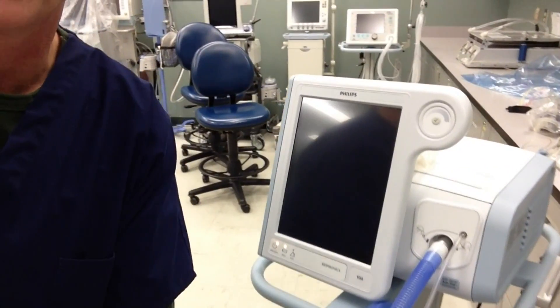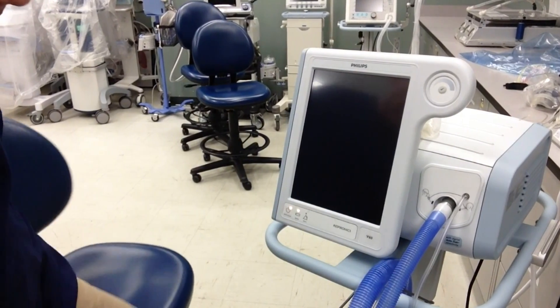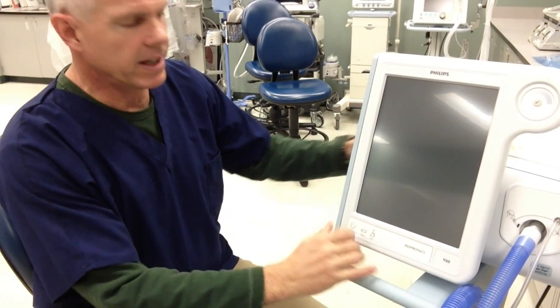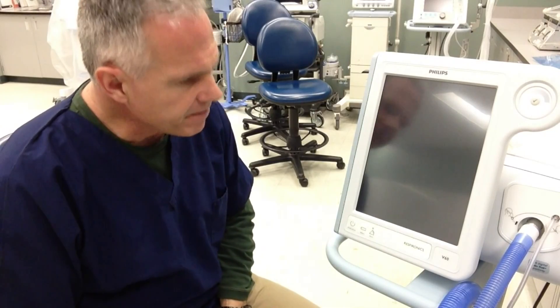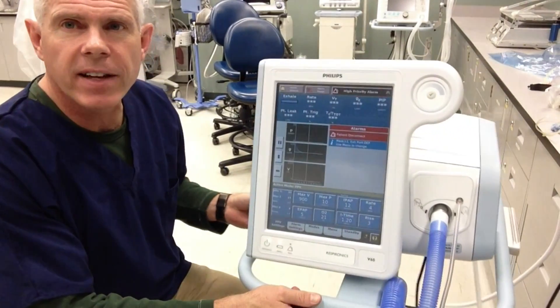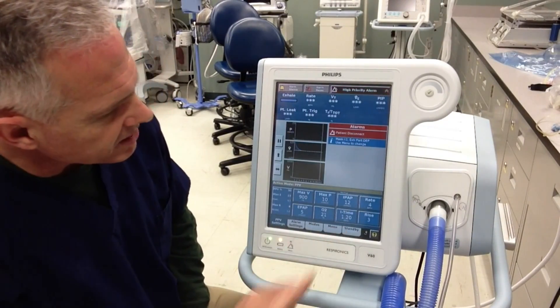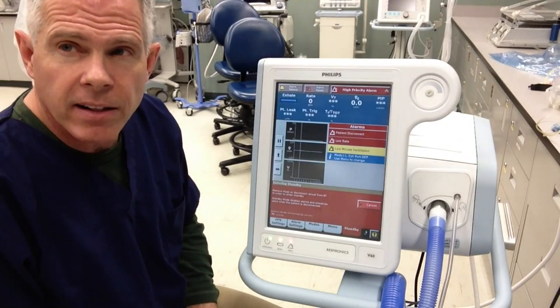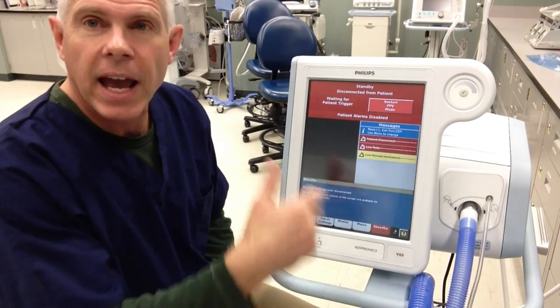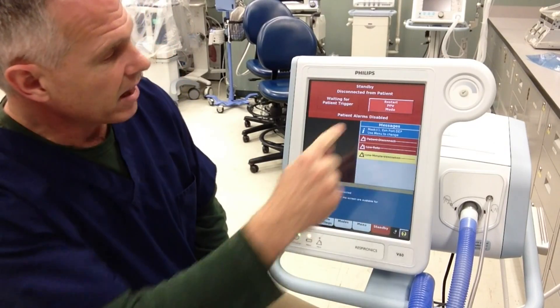So this particular ventilator is very user-friendly. We've got a little power button here. It fires up and, like most of our ventilators, it does a little self-test right off the bat. Right now I'm just going to put it in standby mode. It automatically goes into standby — if it's not sensing any patient respiratory effort, it just goes into standby.